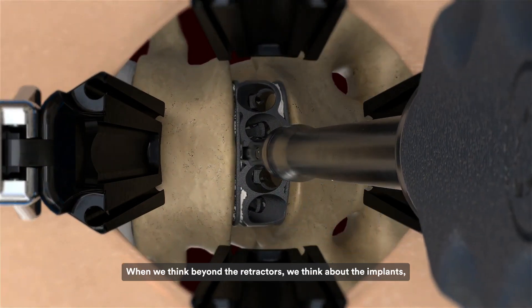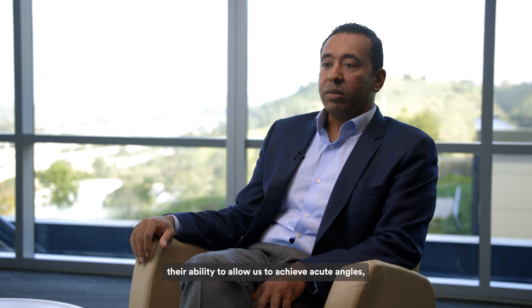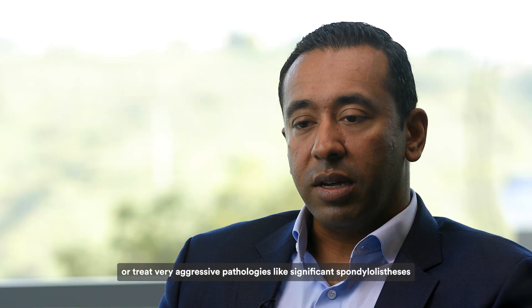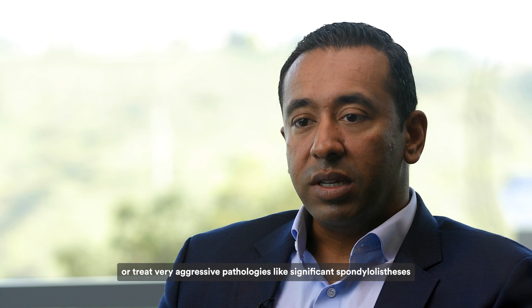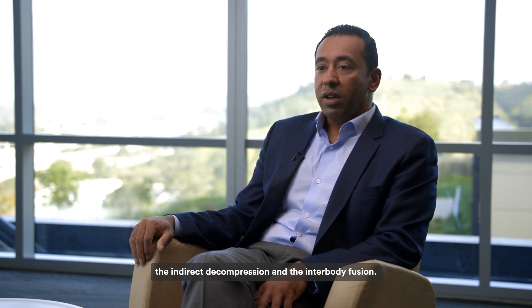When we think beyond the retractors, we think about the implants — their ability to allow us to achieve acute angles or treat very aggressive pathologies like significant spondylolisthesis or high sacral slope patients. All of the instrumentation is designed to help facilitate achieving the indirect decompression and the interbody fusion.